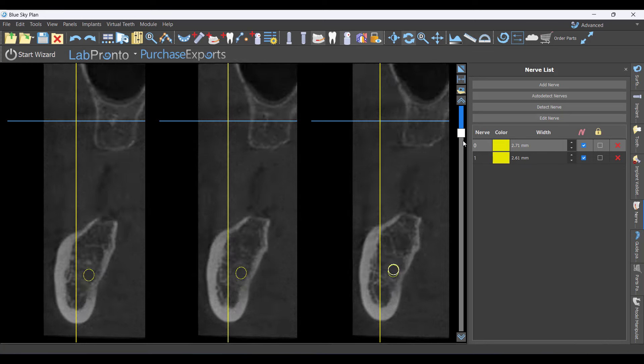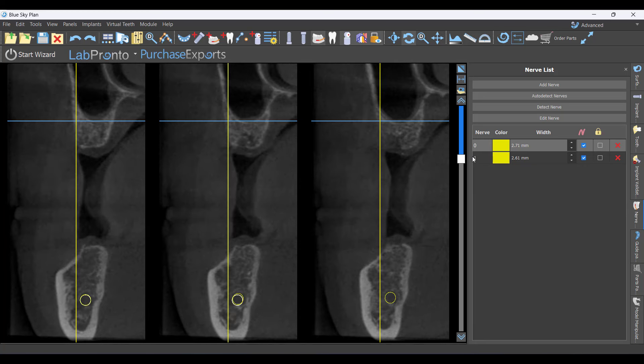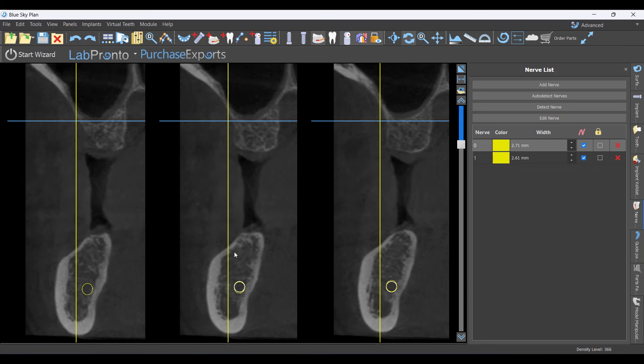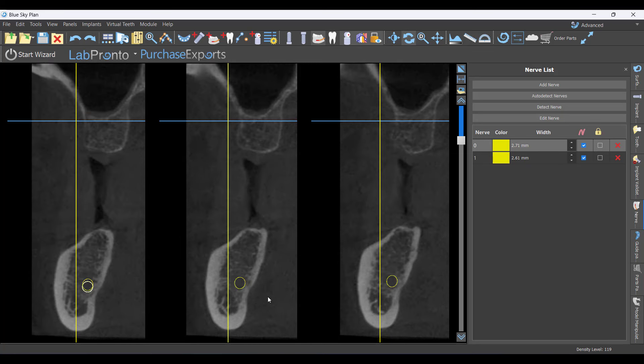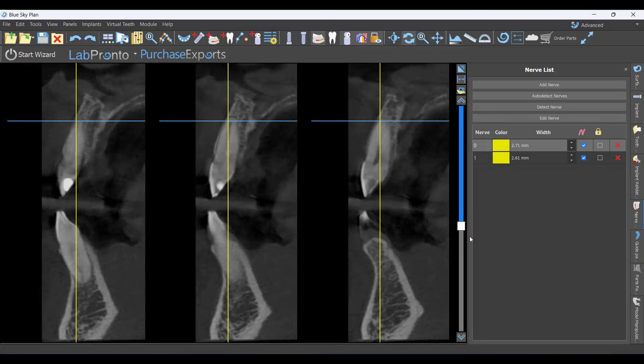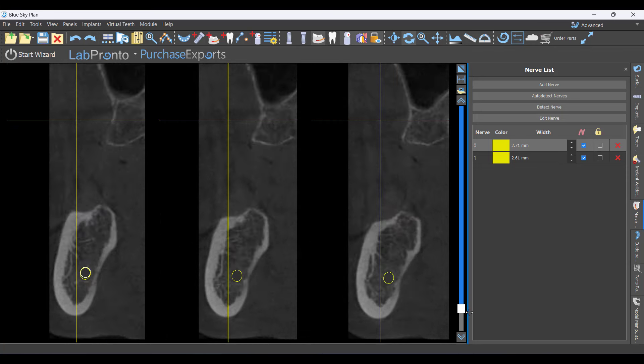Now I can go through and verify my nerves. I like to do that in the cross-section while scrolling through — that looks like a really good nerve map. If there's an area it failed on, such as what I call 'hollow mandible syndrome' where it's a dense cortex with no cortical boundaries on the nerve, those are difficult to map. But if it's off anywhere, I can grab a white node and reposition it.